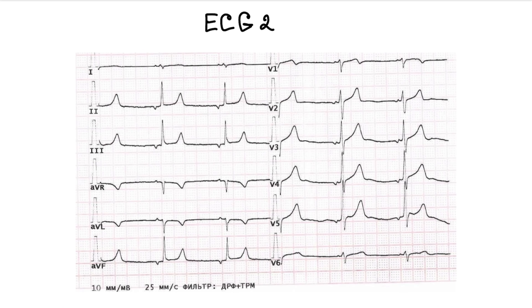Now, let's look at the next ECG. What rhythm is present here? The p-wave is already negative at lead 2 and positive at lead AVR.